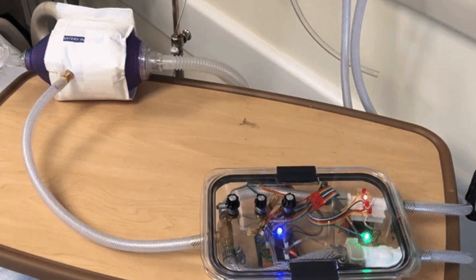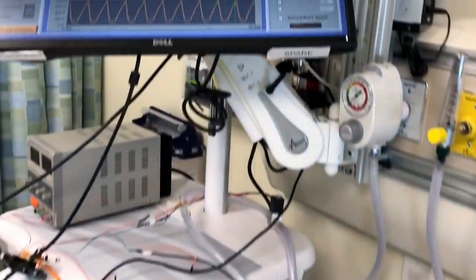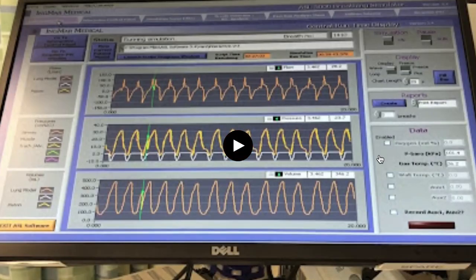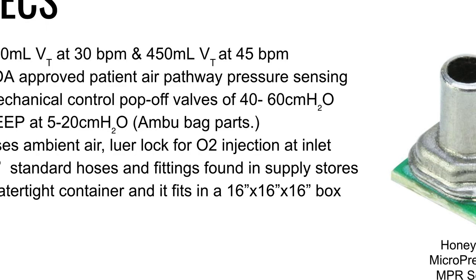Here you can see an animated GIF of URIS in action — operating at 30 breaths per minute and achieving nearly 800 milliliters of tidal volume, and operating at 45 breaths per minute and generating a tidal volume of 450 milliliters per breath. Here are the specs: 800 mL of tidal volume at 30 breaths per minute, and 450 milliliters of tidal volume at 45 breaths per minute.